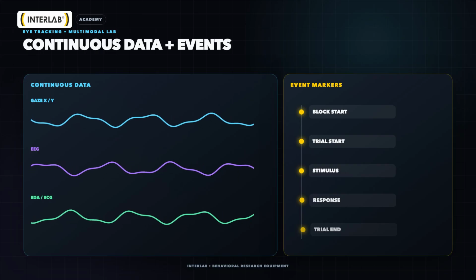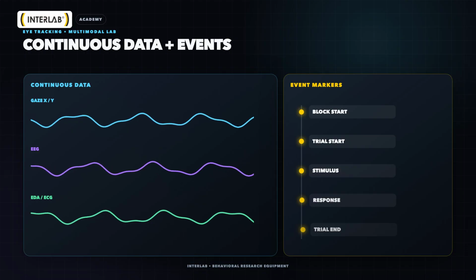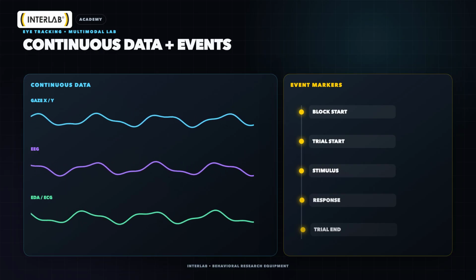A shared recording start does not tell us where a particular stimulus occurs in a long data file. Markers alone, without continuous signals, do not show the response between events.